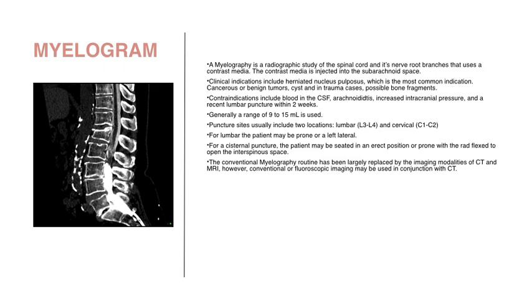For a cisternal puncture, the patient may be seated in an erect position or prone with the head flexed to open the interspinous space. The conventional myelography routine has been largely replaced by the imaging modalities of CT and MRI. However, conventional or fluoroscopic imaging may be used in conjunction with CT.